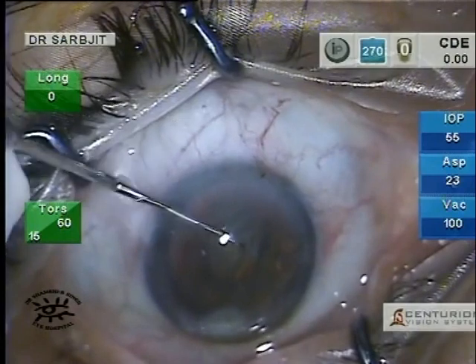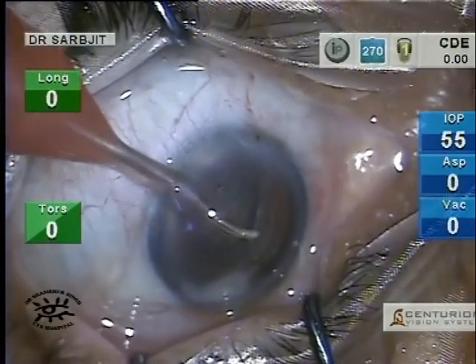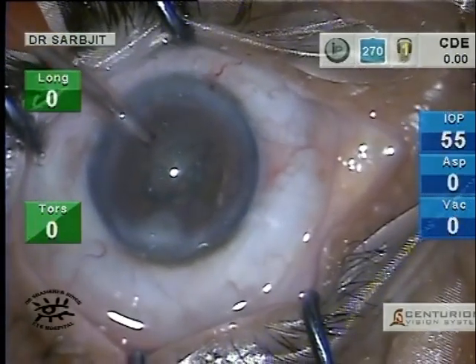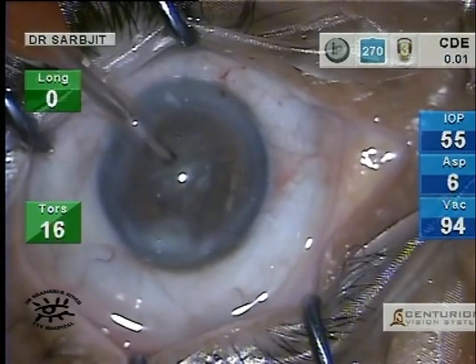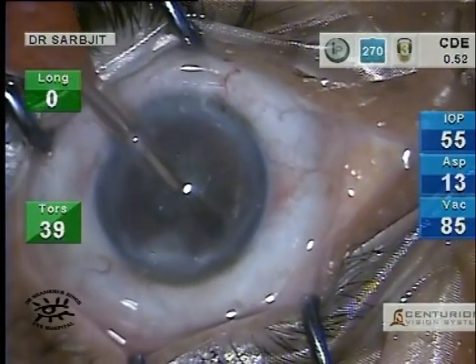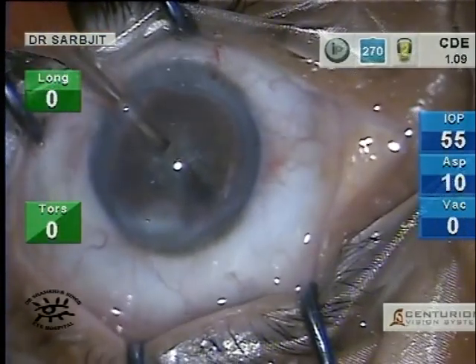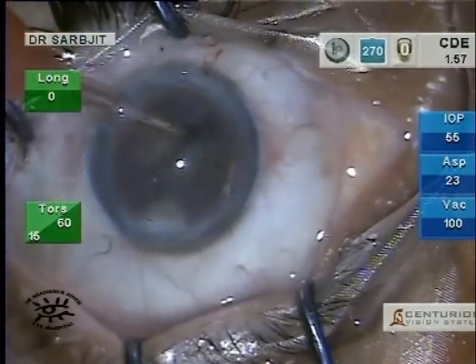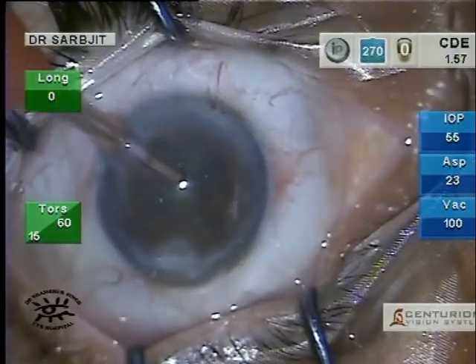This is a balance tip of the Centurion system — I quite like it, it's quite efficient. I'll be doing a stop and chop. You'll see that I've started the sculpting here. It's quite a soft cataract; you might notice that the lens is not moving at all with the movement of the phaco tip, which is a good indicator that your energy levels set are quite adequate. I rotate the nucleus 180 degrees.